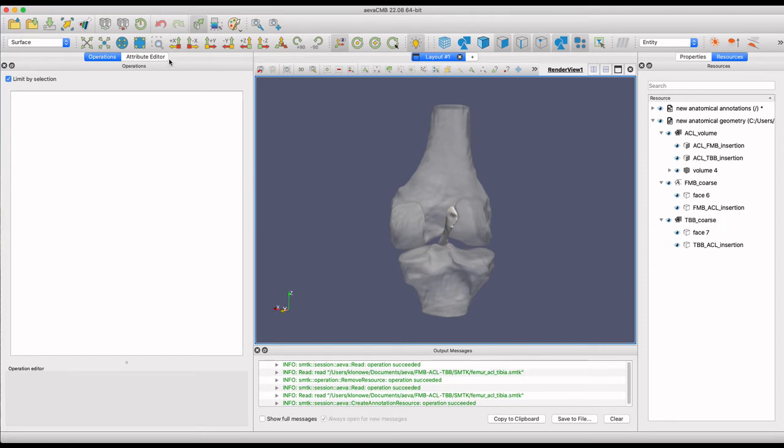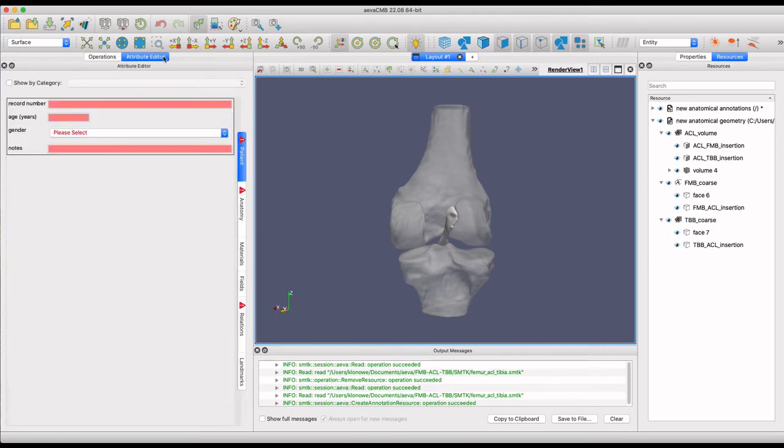Switching to the Attribute Editor, this is where annotations can be assigned to the anatomy. In this case, patient information and anatomy will be used.